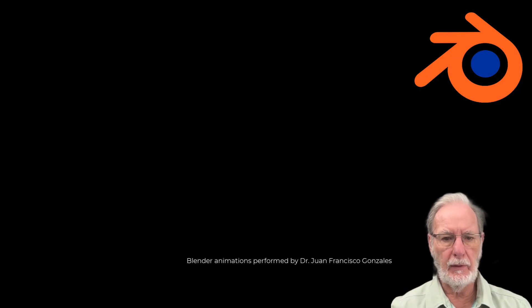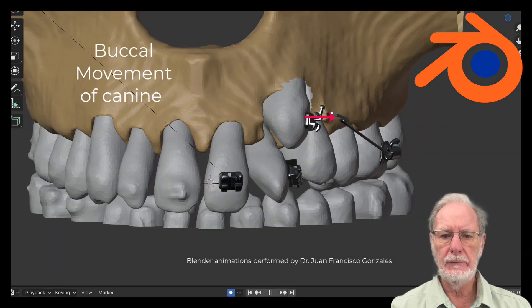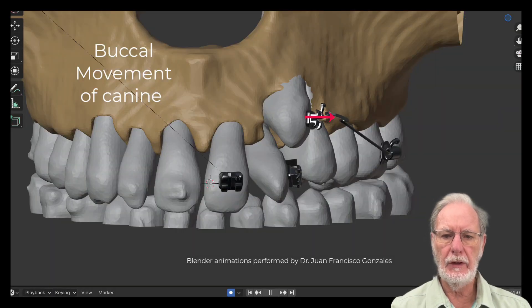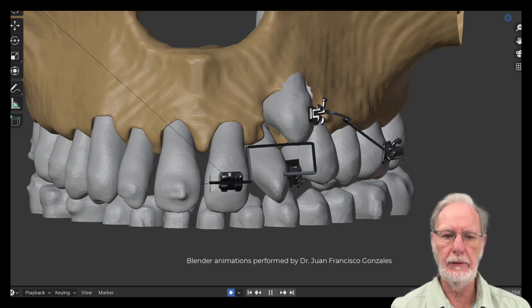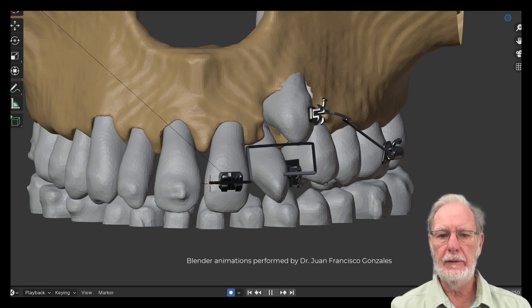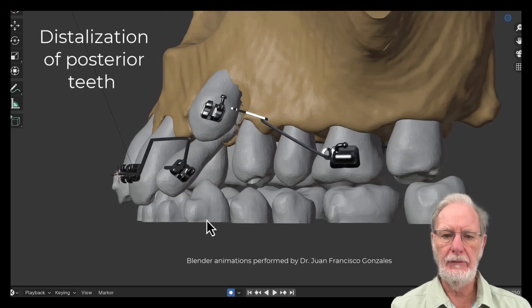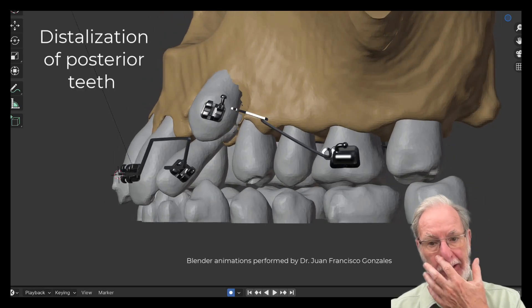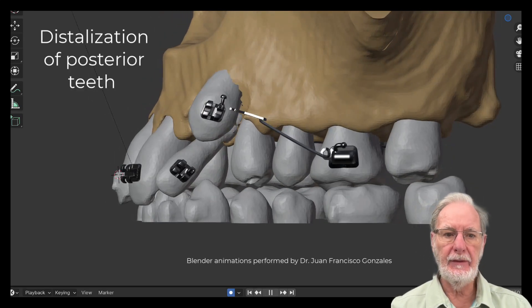Here is the use of Blender in simulation of canine movement. The first step is to move the canine buccally. Then we distalize the posterior teeth. Everything is calculated and self-limiting.